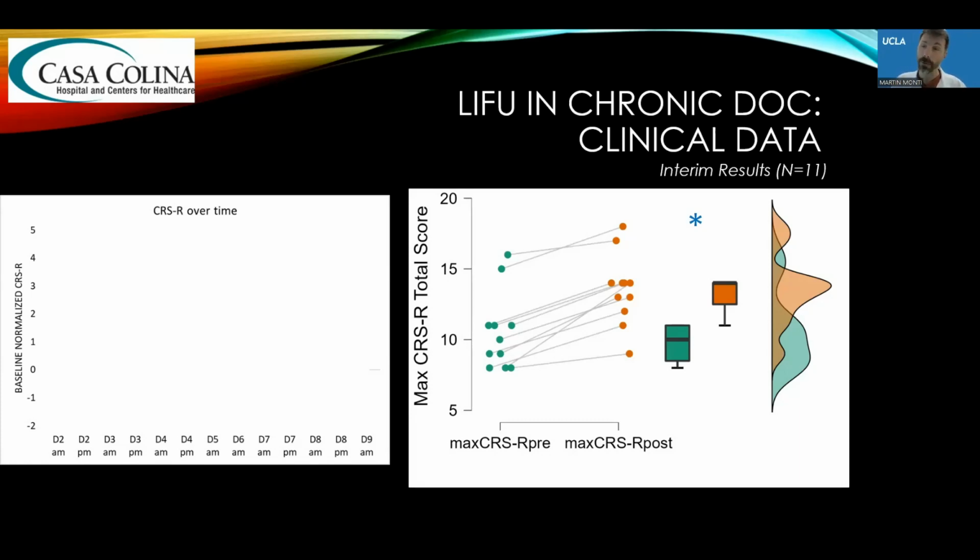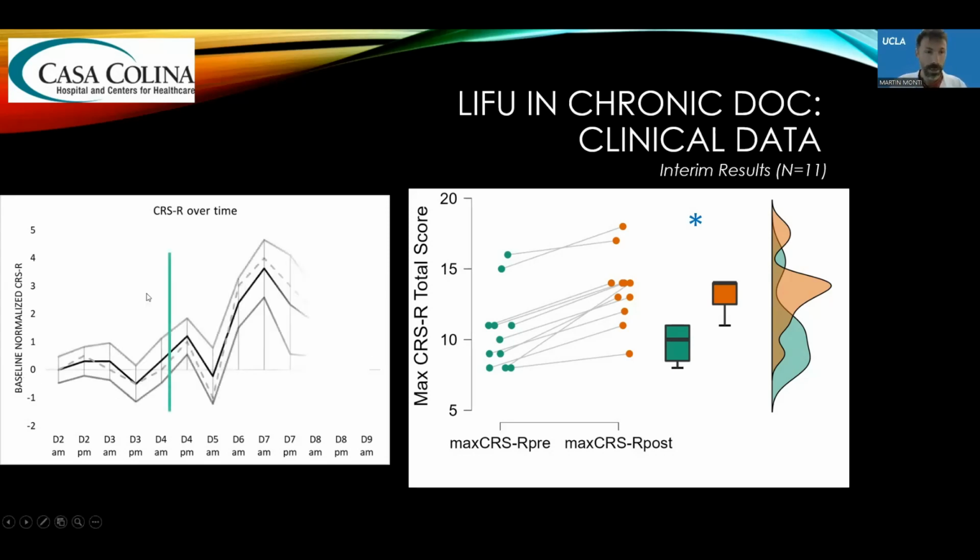What is interesting is that if you look at the unfolding of the effect over time, we see two important things. So you can see here, there's the baseline, then we administer ultrasound, the vertical line, and then we see two things. First, we see a clear depression in behavior in the patient, which we had observed also in the initial trial.